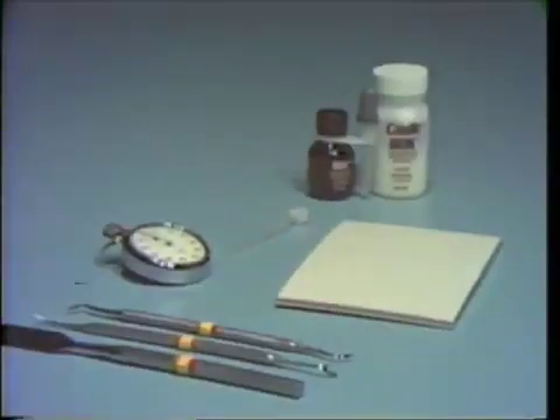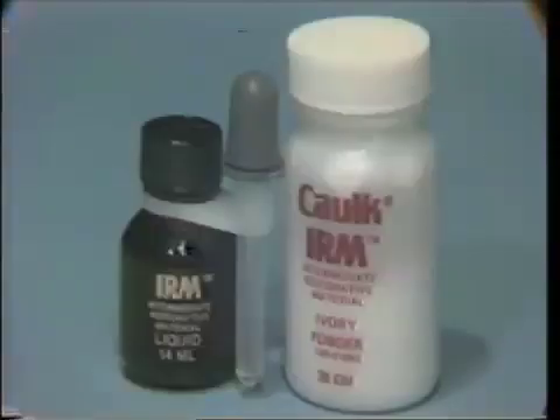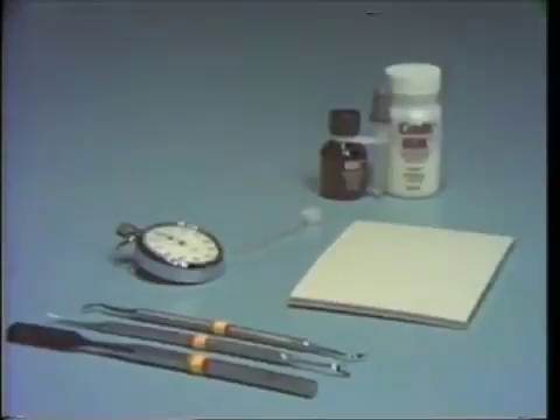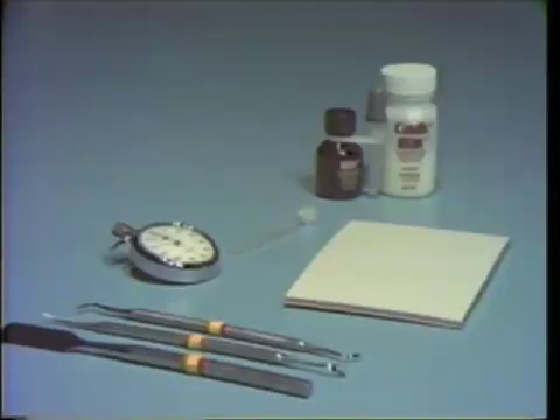We would like to demonstrate for you the mixing of a polymer reinforced zinc oxide eugenol cement. The material that we'll be using in the laboratories and clinics is called Intermediate Restorative Material or IRM, manufactured by the L.D. Caulk Company in Milford, Delaware. The primary use for this material in dentistry is for long term temporization or as an interim restoration during prolonged operative procedures. The armamentarium required for mixing is the IRM powder and liquid with the dropper for dispensing liquid onto the pad. A measuring scoop is provided by the manufacturer for volumetrically measuring the powder. A medium sized parchment mixing pad is used as the mixing surface — parchment being preferable to paper, as it will resist the absorption of the liquid into the mixing surface during dispensing.